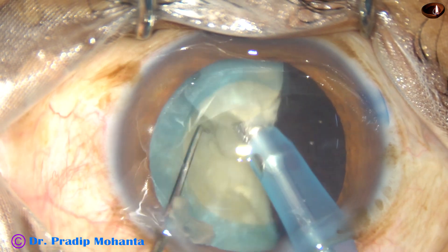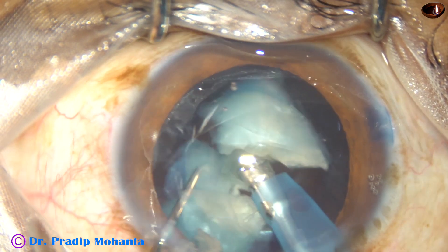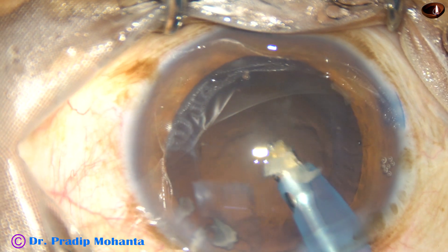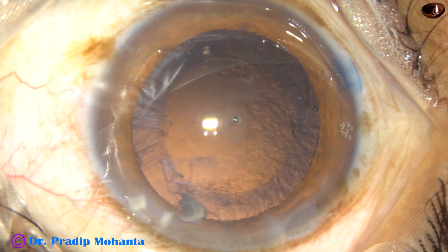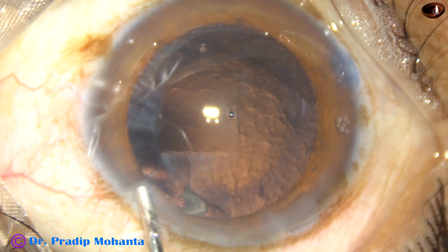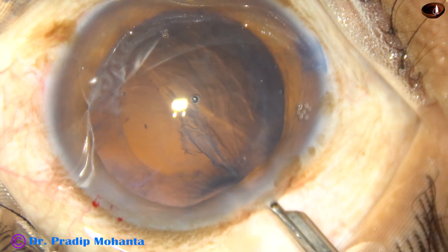One hemi-nucleus has been managed. And this is the other hemi-nucleus — it has tumbled. This nucleus is very brittle, and such nuclei are very easy to chop and divide into fragments. The nucleus has been removed. We can see a small bit of nucleus near the left side port. So I want to remove that small piece first. Some small bits were incarcerated in the side port, and I am going to remove this small piece. Yes, it has come out.